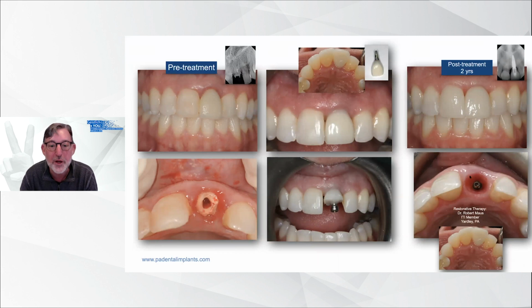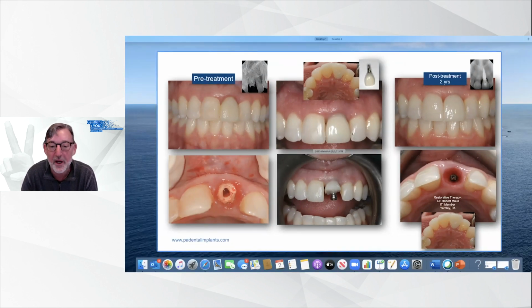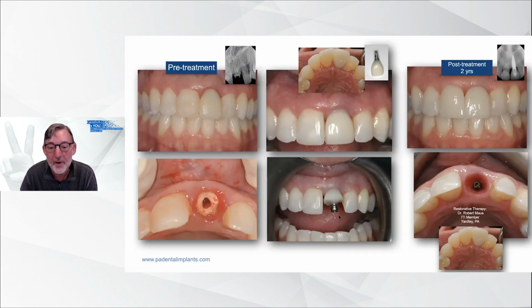And going from pre-treatment, this is the key when it comes to the placement of the provisional, custom impression coping technique, which are 2 of the keys also, which is key number 7 and 8, and key number 9, and number 10 is the screw-retained restoration. Seeing the thickness of that tissue again, and seeing the coming back of the papillas, and that could take up to 3 years or more in these cases. And again, looking at the depth of these implants.